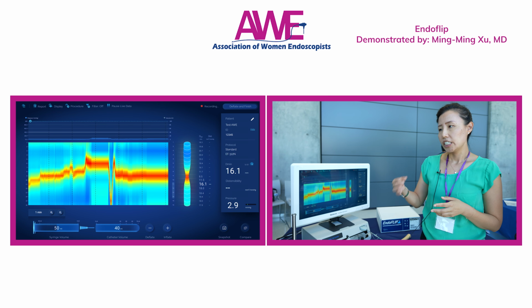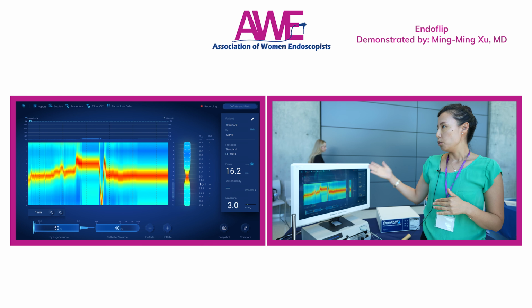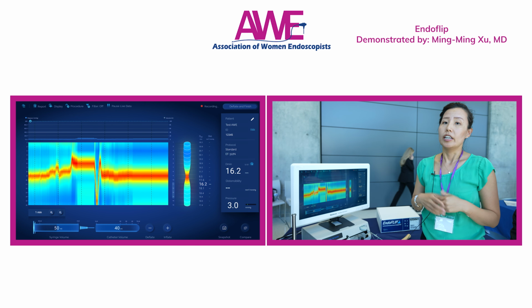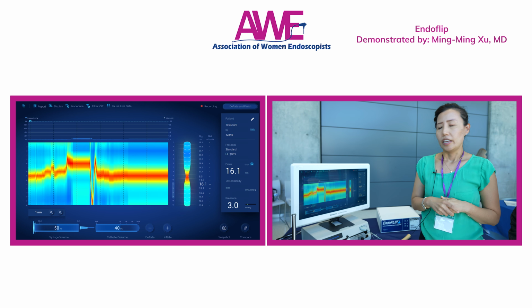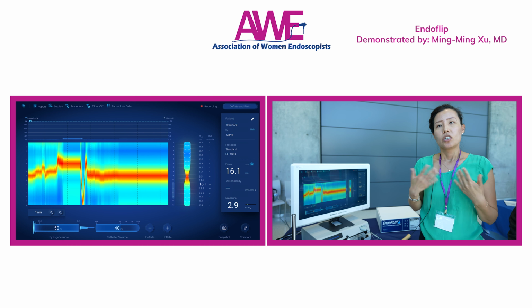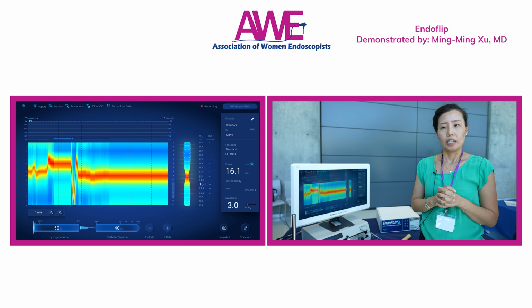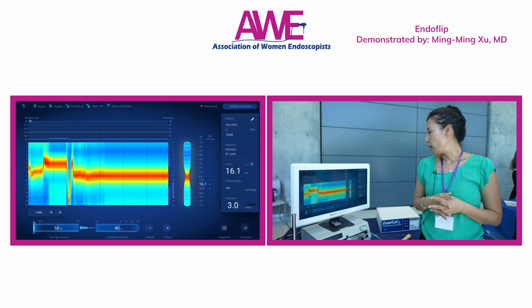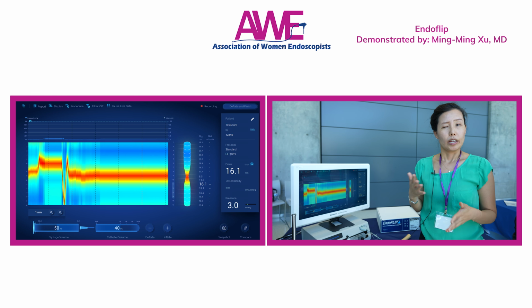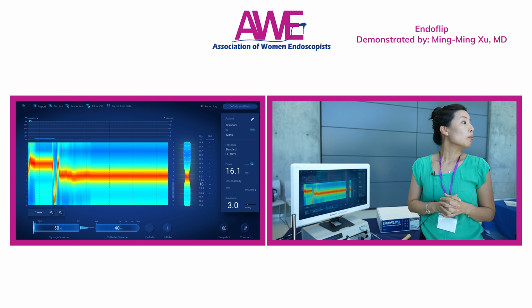So if you have a very tight LES prior to your myotomy, post-POEM you do this measurement again, and you should hopefully see a significant improvement in both the diameter and the distensibility index. Generally, the data suggests that if you have a post-myotomy distensibility index above 3.5, that suggests there is an adequate myotomy. So that's where it's clinically most useful, I think.